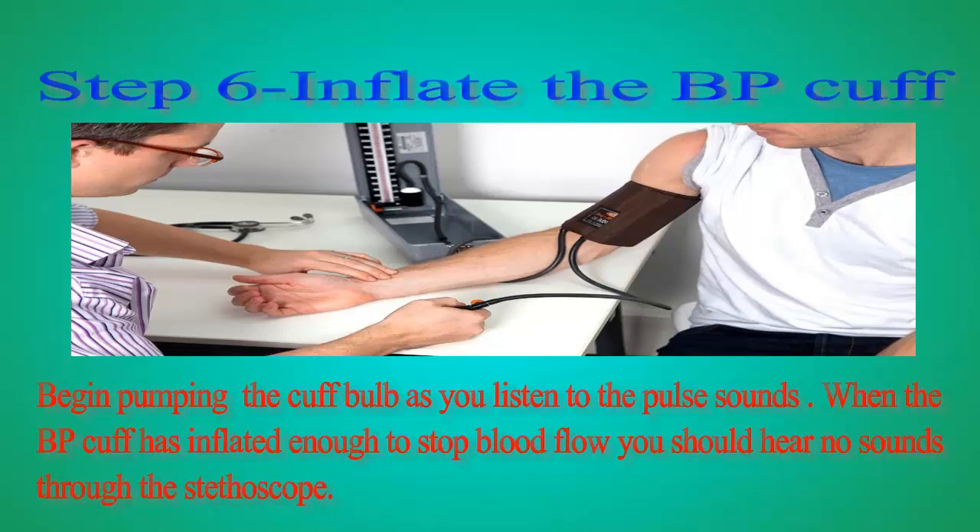Step 6: Inflate the BP cuff. Begin pumping the cuff bulb as you listen to the pulse sounds. When the BP cuff has inflated enough to stop blood flow, you should hear no sounds through the stethoscope.